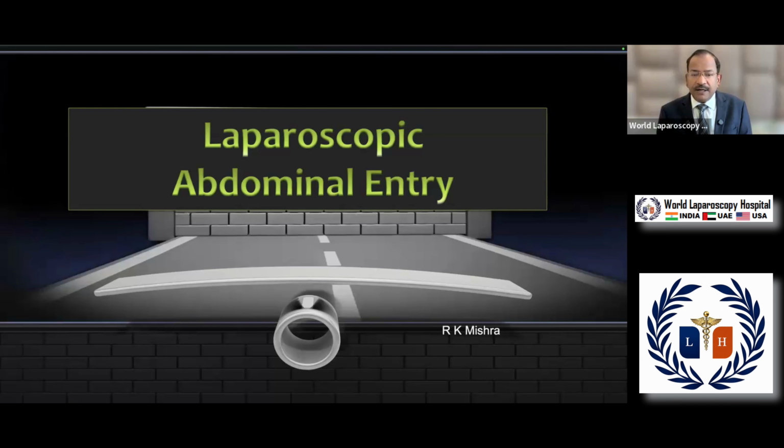And it is very important that the first access you are doing should be performed very safely, because 50% of the complications of laparoscopic surgery happen due to wrong access. So, if you have done the correct access, correct entry, then almost 50% of the work is done.